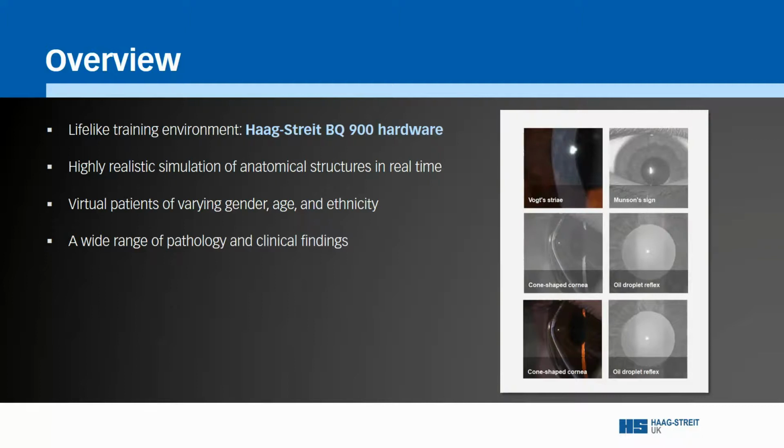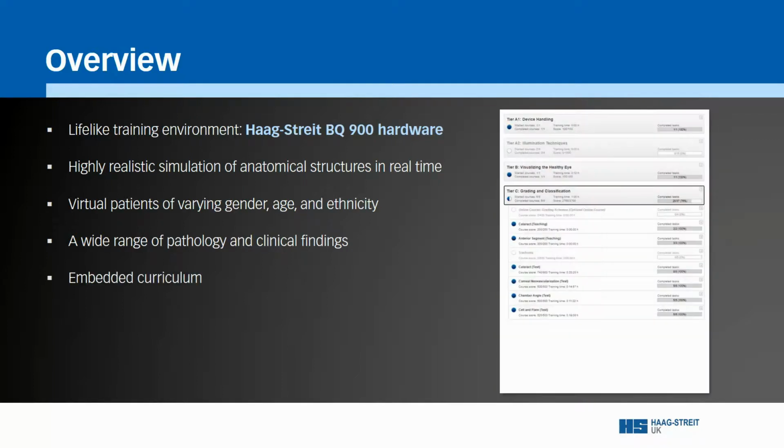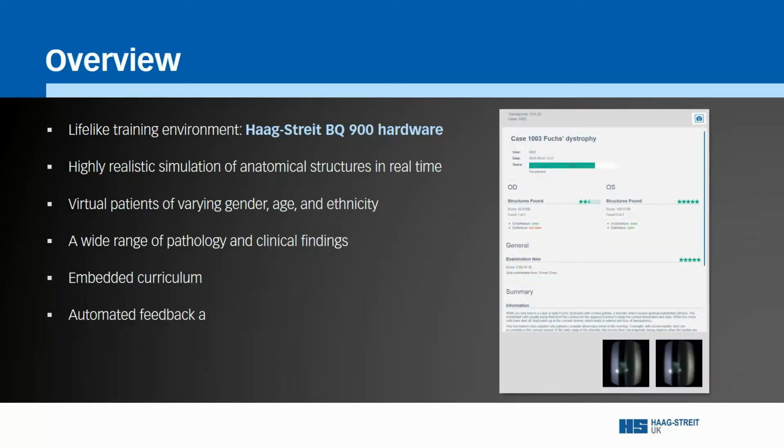The range of pathology in clinical cases covers all areas from the lids and lashes through the anterior segment into the posterior eye and onto the retina using the new Fundoscopy functionality. Eyesi simulators are equipped with comprehensive embedded tiered curricula structured to take trainees from novice to experienced slit lamp operator. The onboard training software also provides comprehensive feedback and performance evaluation.